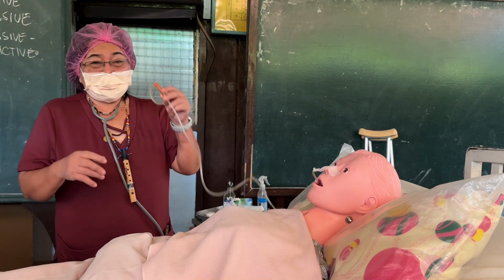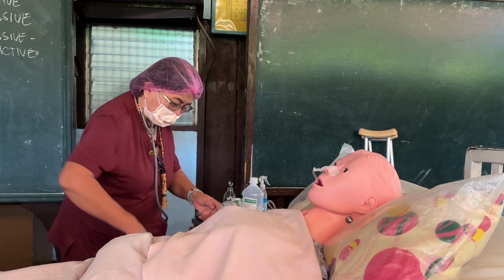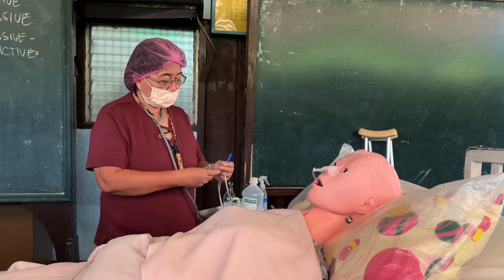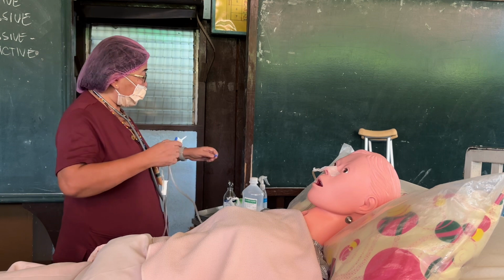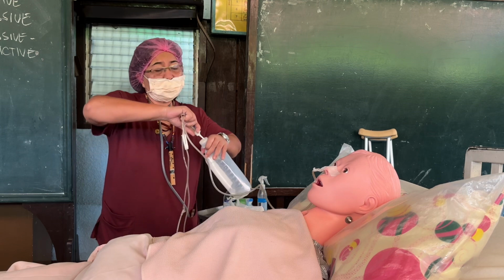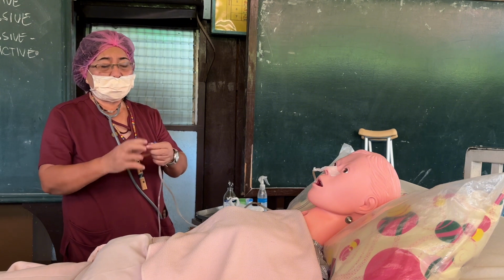So you just open this one and pull it lower. Once you drain it, it flows directly. Of course, it cannot reach the ground, it's still short, so you need a connecting tube. We are a resource-limited hospital, so we connect it ourselves. Place a receptacle at the end. You should prepare many, because with such an enlarged abdomen, it will spurt out. Then we connect this end to the tip of the NGT.